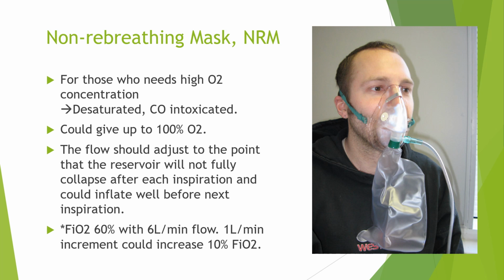The non-rebreathing mask could give up to 100% oxygen, and the flow should be adjusted to the point that the reservoir will not fully collapse after each inspiration and could inflate well before the next inspiration. The fraction of inhaled oxygen will be 60% with a flow of 6 liters per minute, and may go up to 100%. You can see the picture on the right side.